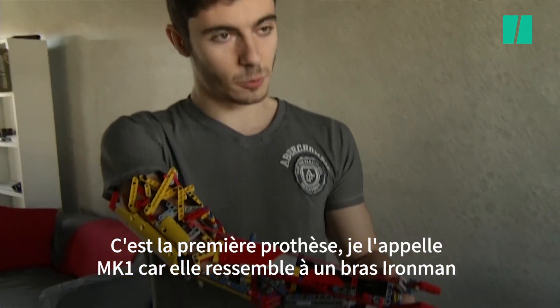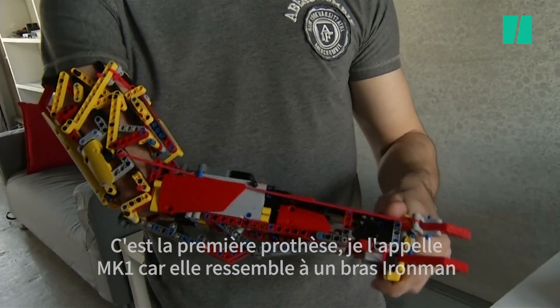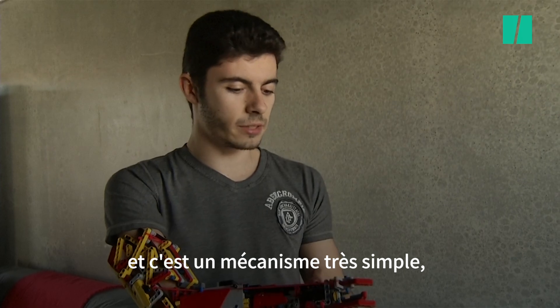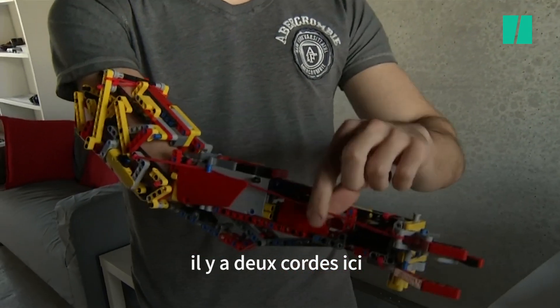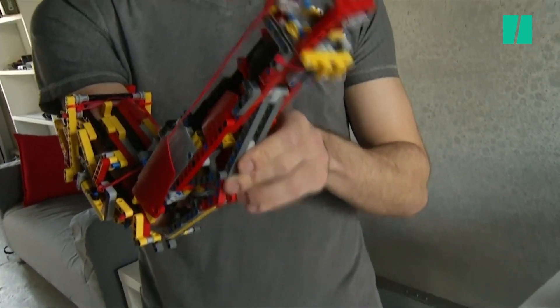This is the first prosthetic. I call it the MK1 because it looks like an Iron Man arm. And it's pure mechanical. I can move it like this. It's a very easy mechanism — it's just like two cords in here that tie when I close the arm.